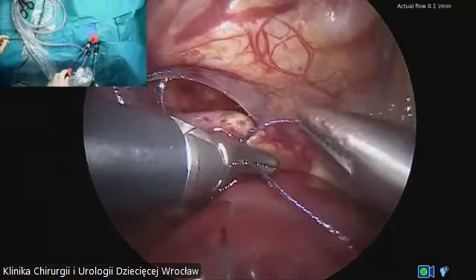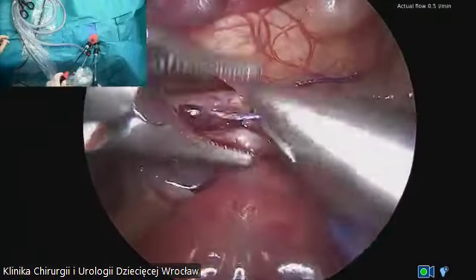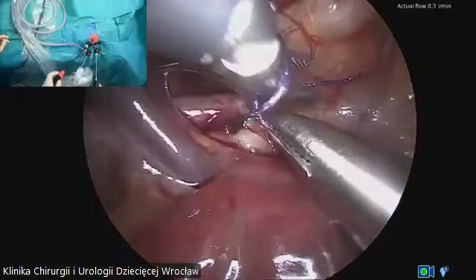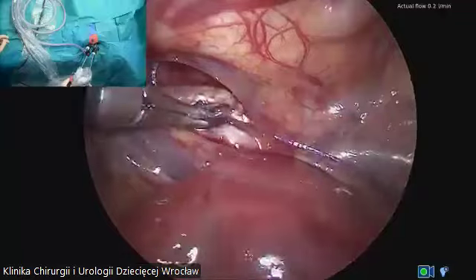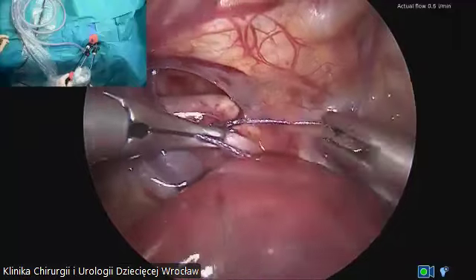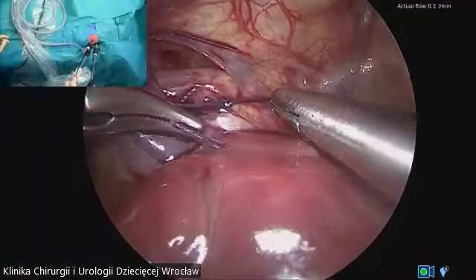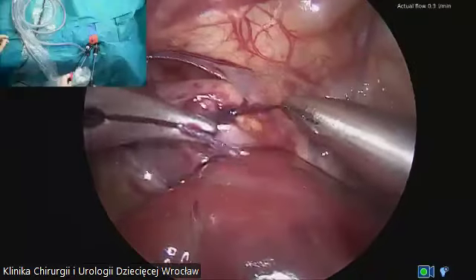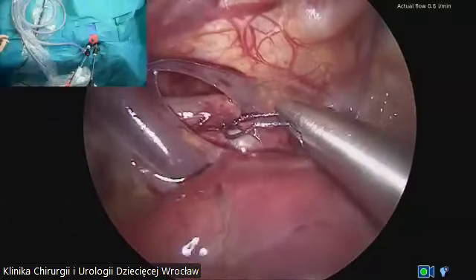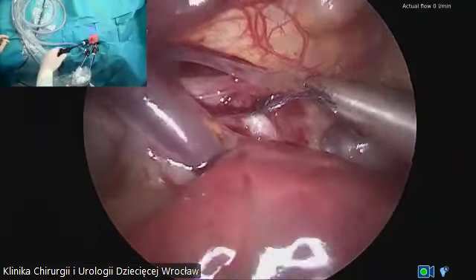Okay, so the fistula is ligated, you know, and I know a lot of stories from people who just only ligated the fistula that it will recur in 2 or 3 weeks. But we are not going to wait so long, so I'm not afraid about it. So this is why I don't cut it. And because sometimes if we have some tension, the distance between the upper and lower pouch, we could put traction just taking them together. But in this case, it shouldn't be any problem. So we'll do nothing more, just only cut. And this is the end of our procedure.